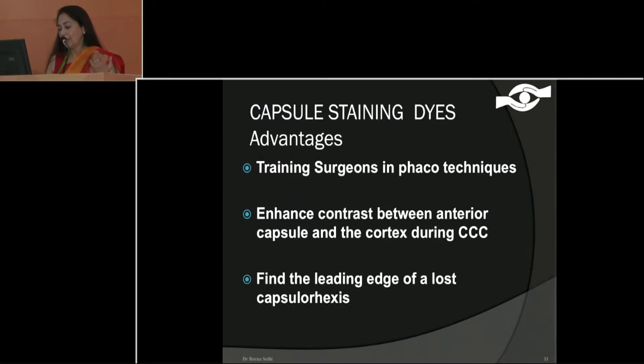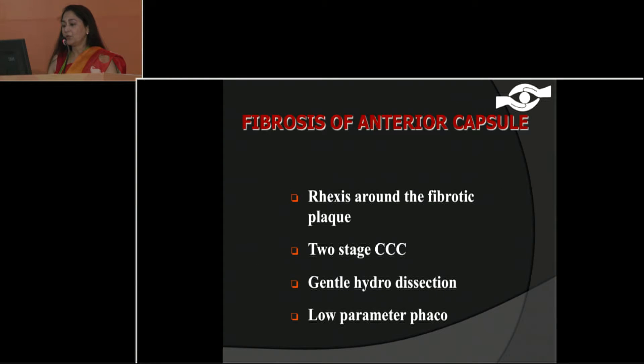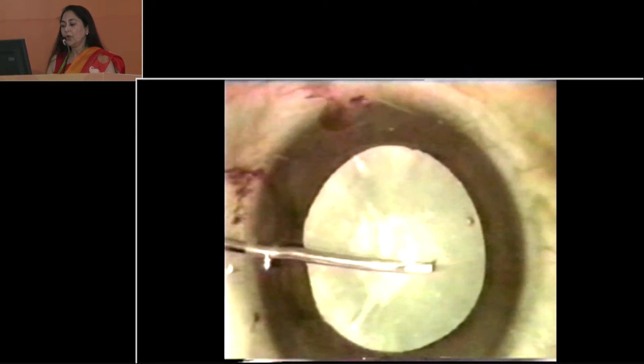Positioning is very important and put methylcellulose on the cornea — it gives you a magnifying view. Staining is important if you are dealing with traumatic cataracts or need some enhancement of the anterior capsule to differentiate it from the cortex, and especially in corneal opacities. If you are having any difficulty, do a smaller capsulorexis first — this is more controlled — and then you can enlarge it.